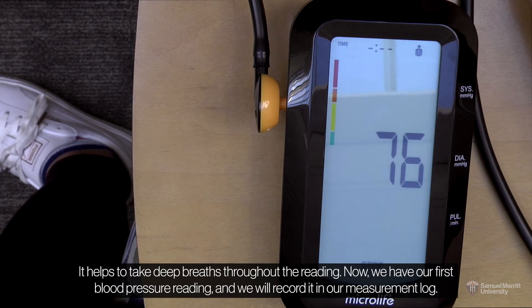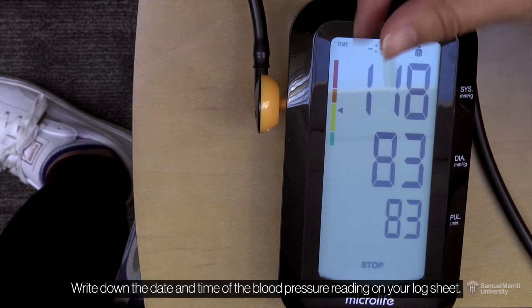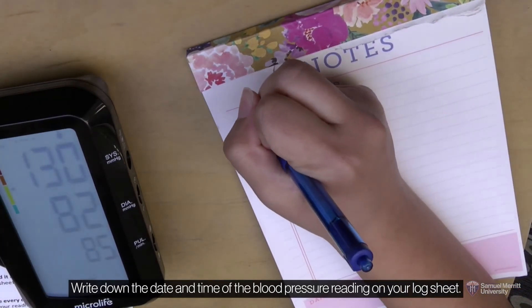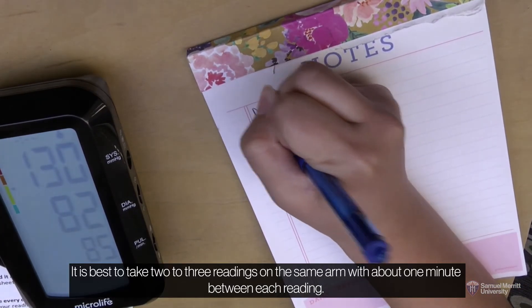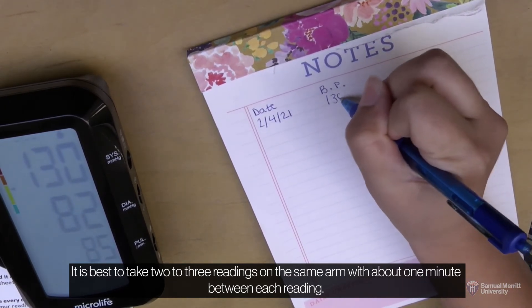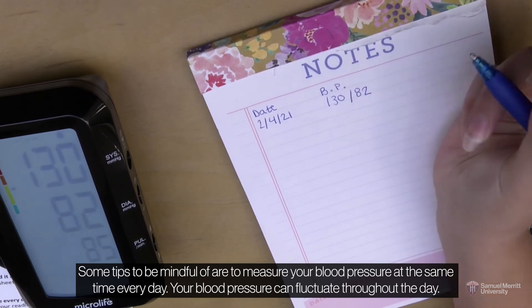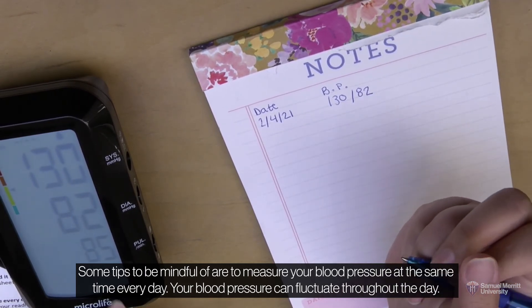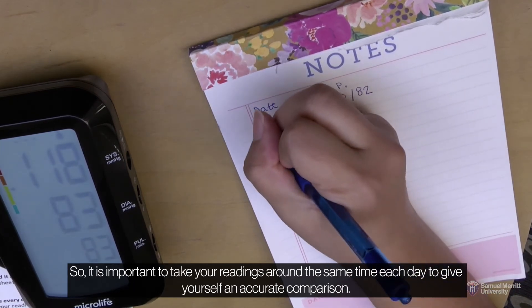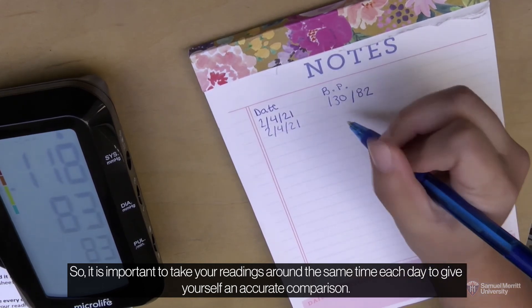Now, we have our first blood pressure reading and we will record it in our measurement log. Write down the date and time of the blood pressure reading on your log sheet. It is best to take two to three readings on the same arm with about one minute between each reading. Measure your blood pressure at the same time every day, as your blood pressure can fluctuate throughout the day, so taking readings around the same time each day gives you an accurate comparison.